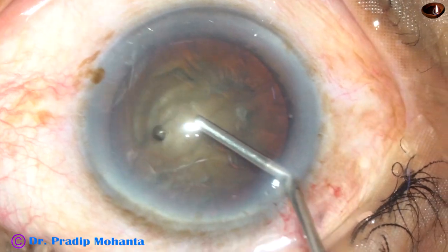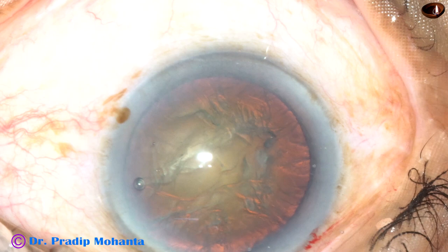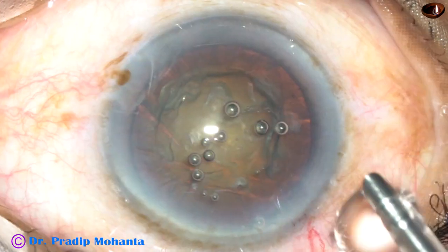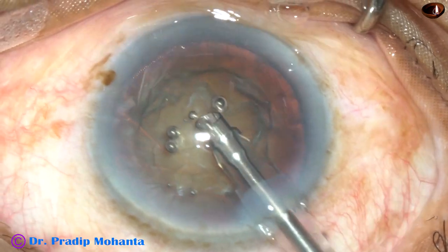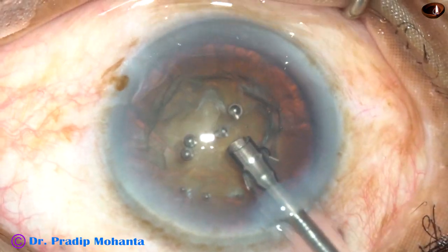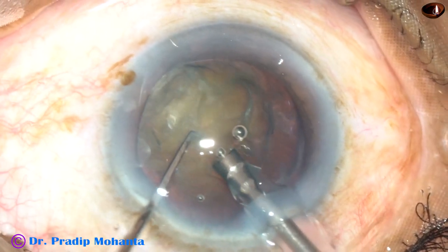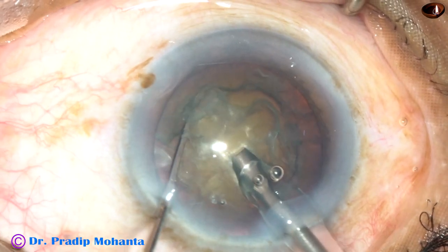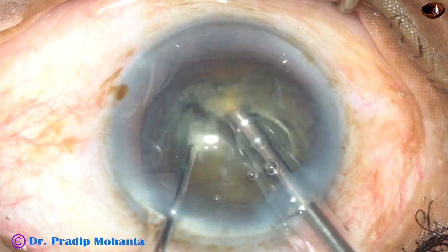Visco is injected, and then the 2.2 mm tip attached to the phaco handpiece is being introduced into the anterior chamber — bevel down first, then it is turned and bevel is up now. This is direct chop: bury the tip into the substance of the nucleus, go for a distance, and then chop.